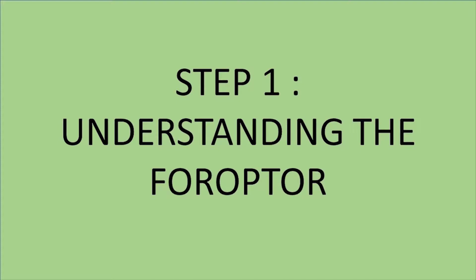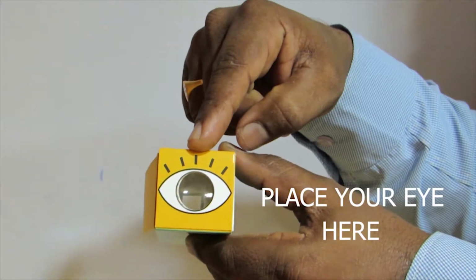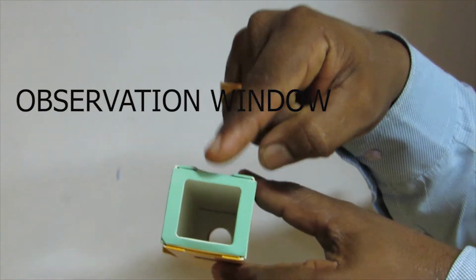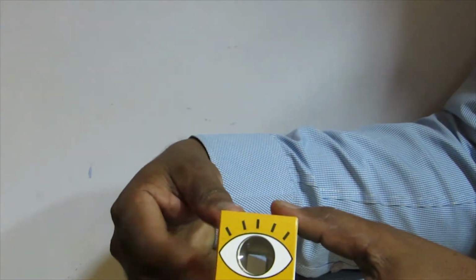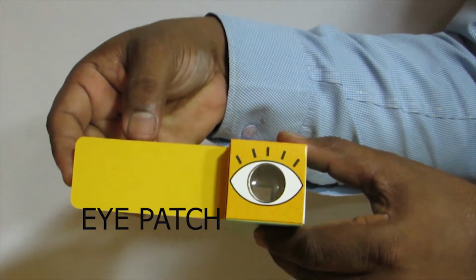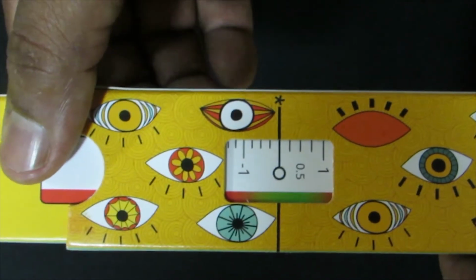Understanding the Foropter. The Foropter has a lens on the side where you have to place your eye. The other side has an observation window. At the side of the lens, there is a flap which is called the eye patch, which you can use to block the other eye. On the top, you can see the results.